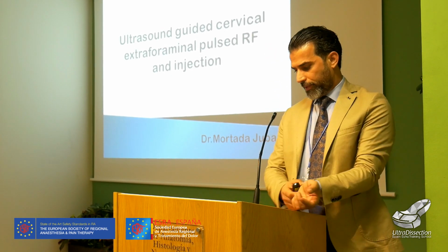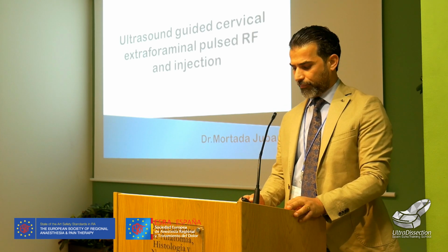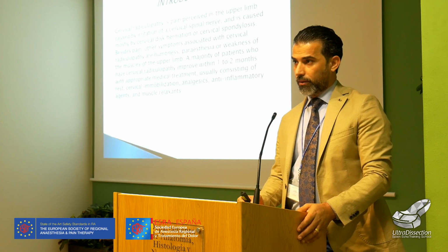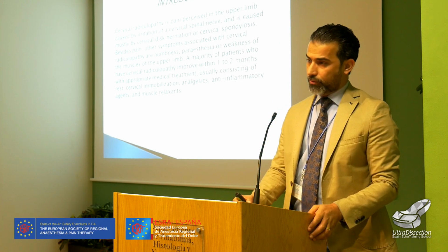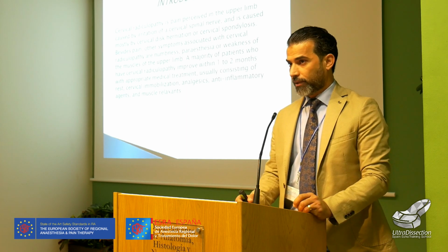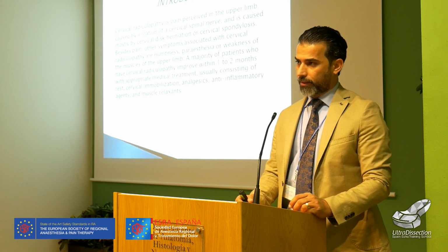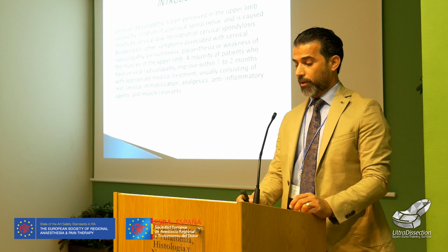My lecture today is about ultrasound-guided cervical extraforaminal pulse radiofrequency and steroid injection. All the doctors working in pain management know cervical radiculopathy, which is a pain perceived in the upper limbs caused by irritation of the cervical roots.